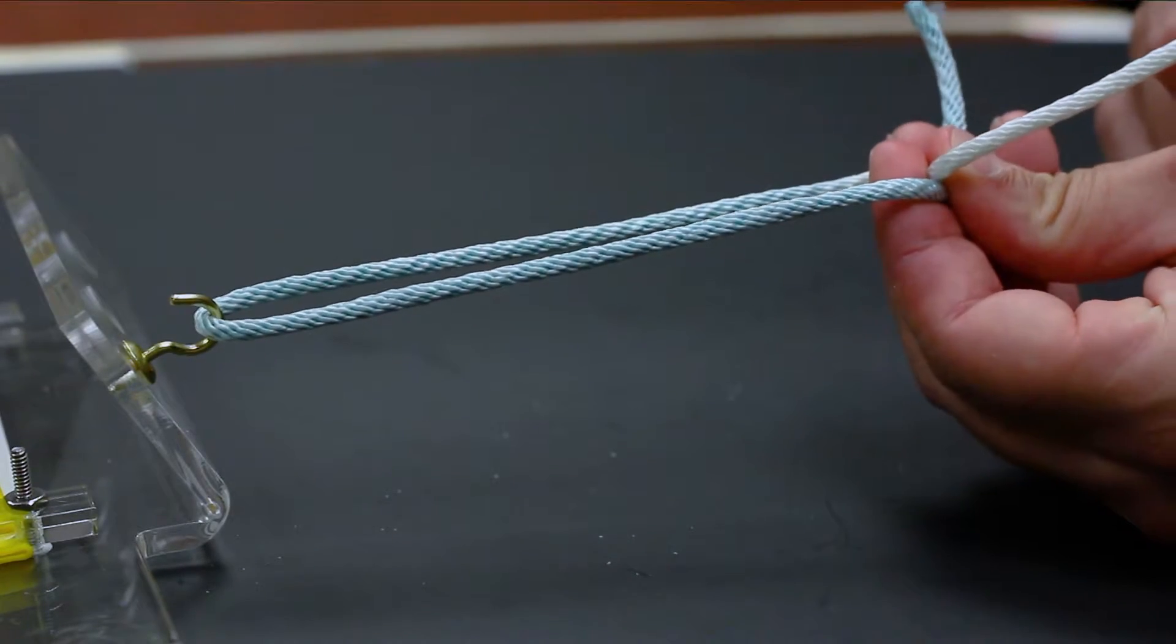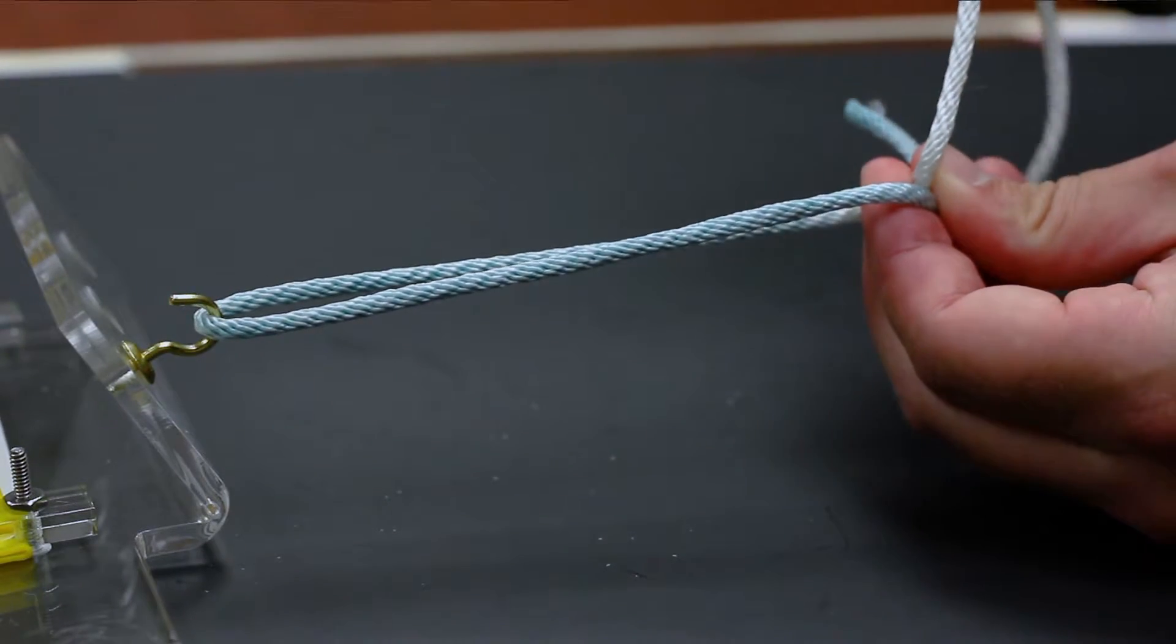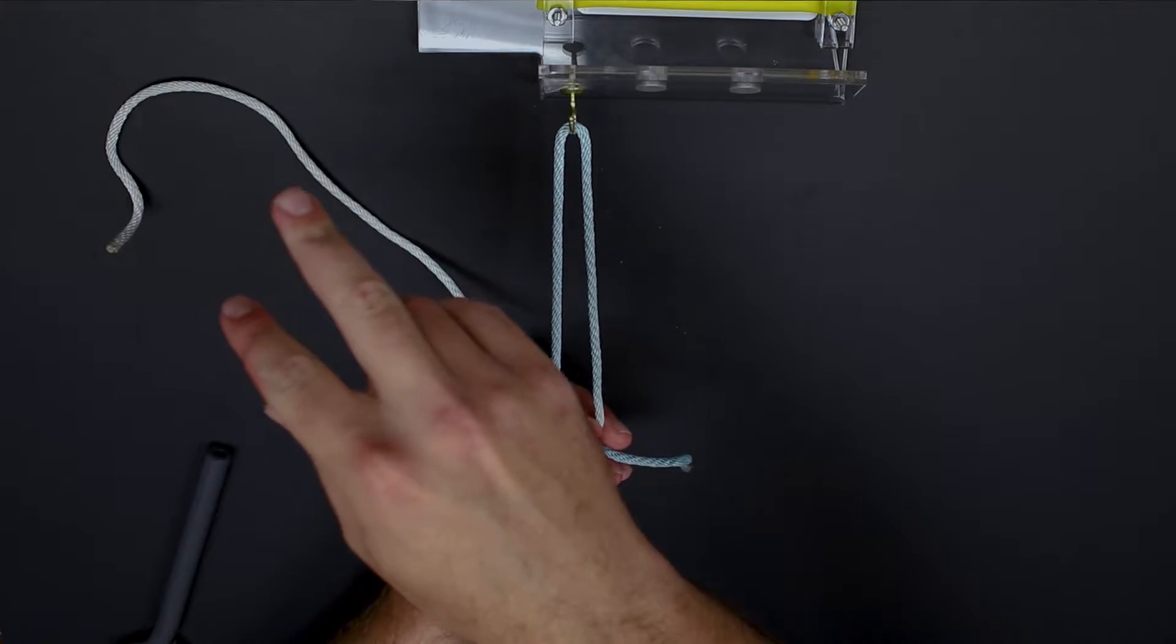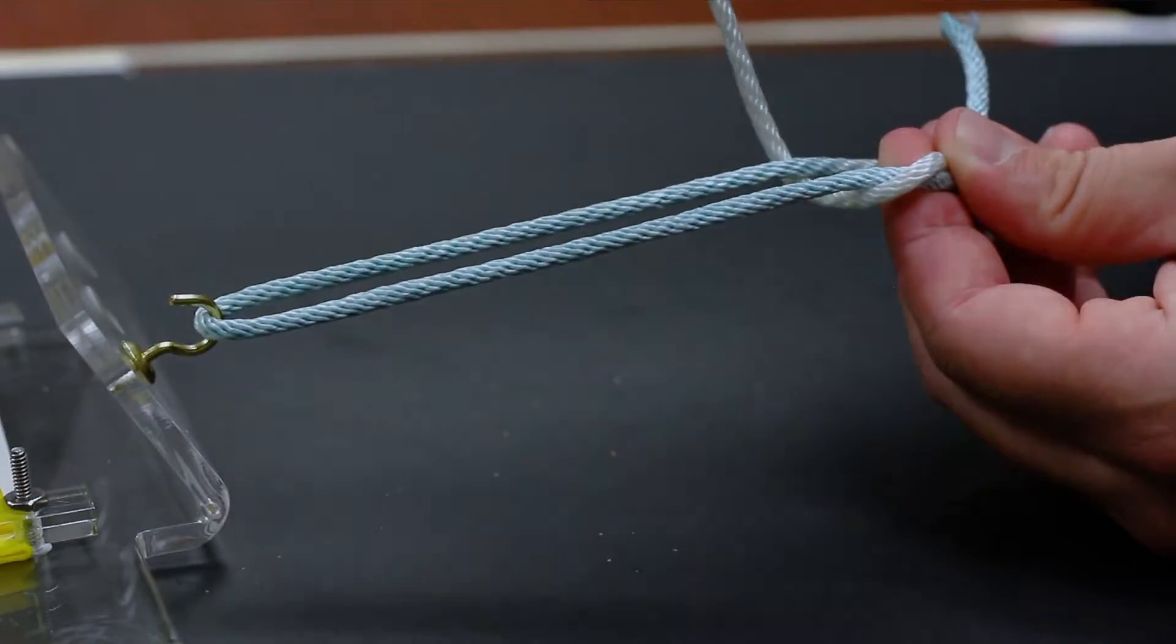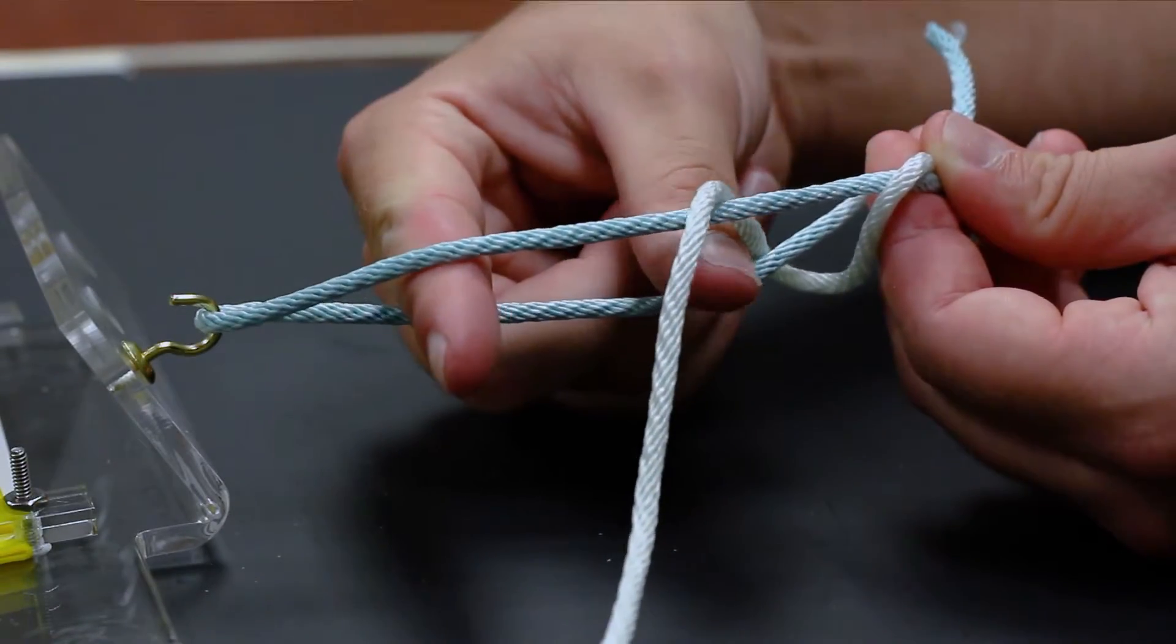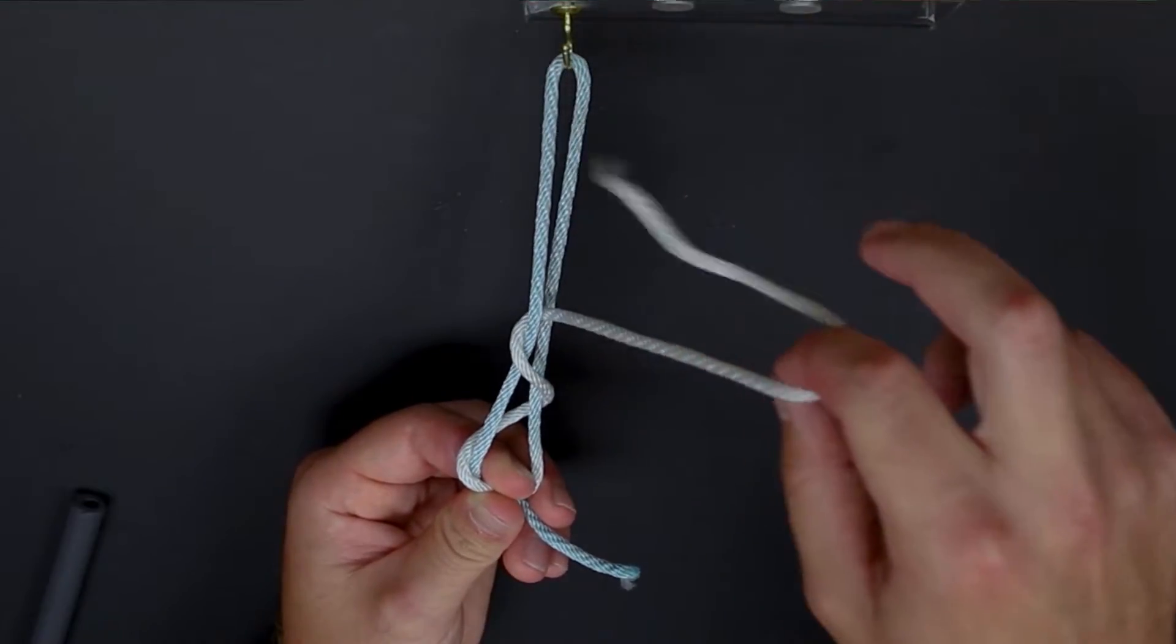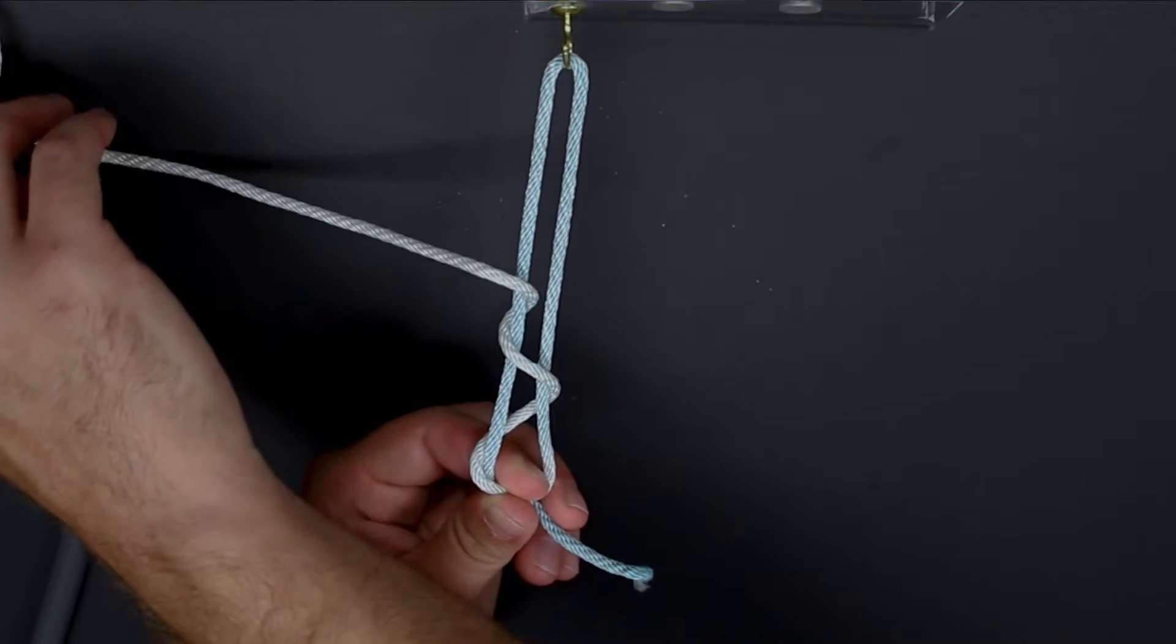We begin by first pinching the two limbs between the index and thumb. We then bring the loop limb over the top, underneath, over the top once more, and then we bring our fingers through the two loops and then over again.